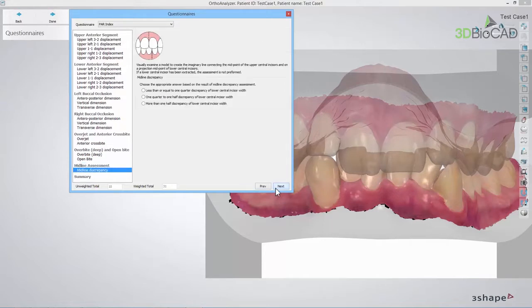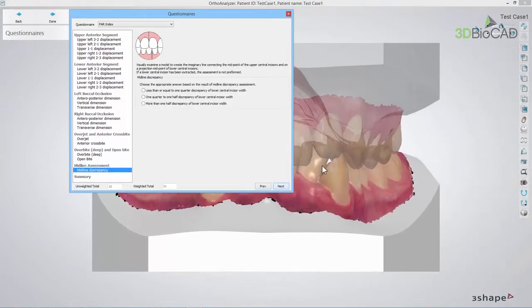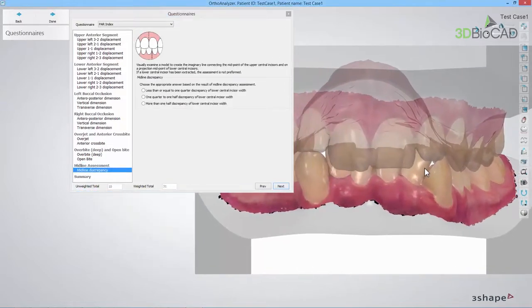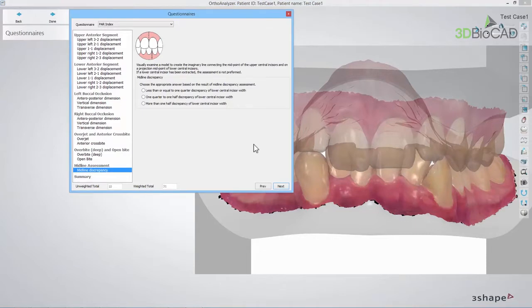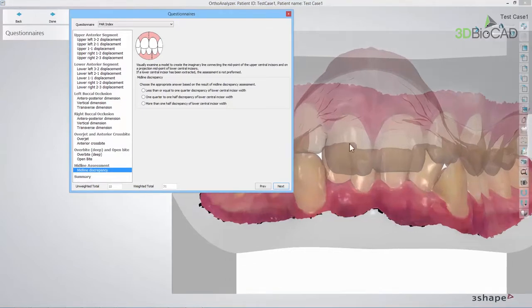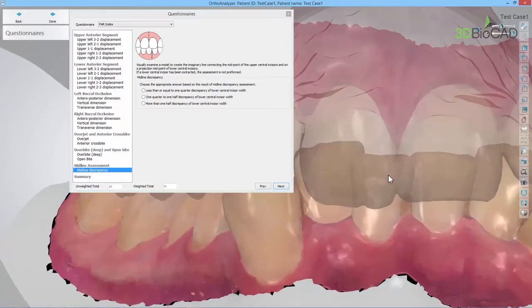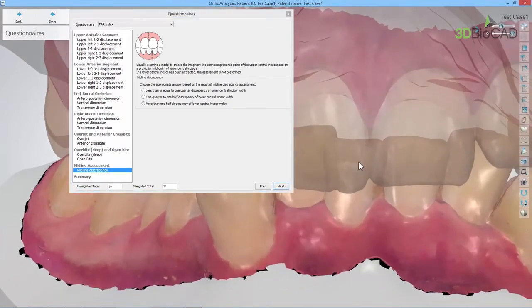In the Midline Assessments section, the transverse discrepancy between the upper and the lower center line going through the central incisors is assessed. You should inspect the model and choose the appropriate answer.